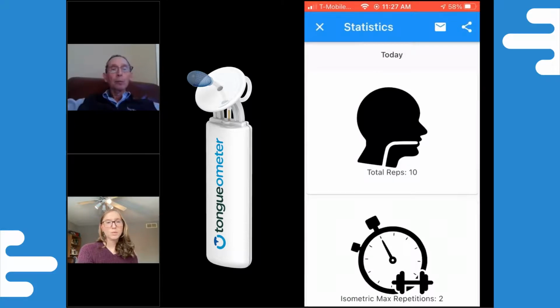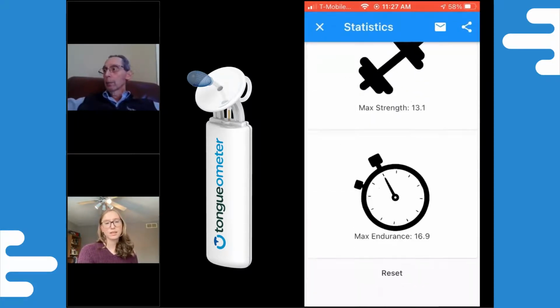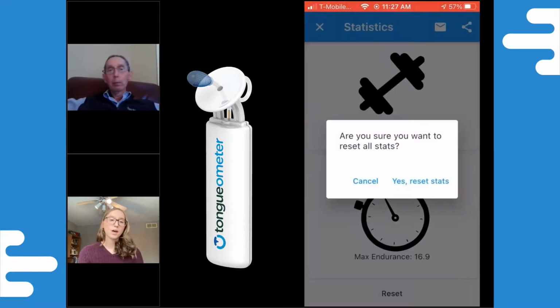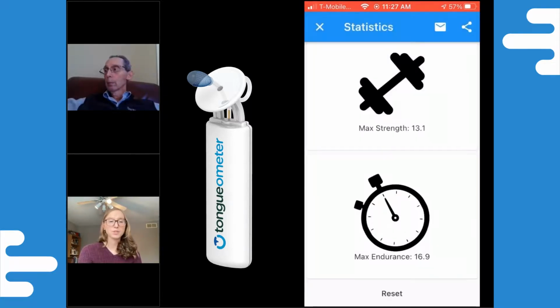And then also, if you wanted to reset the data, if you were using a shared tablet or phone in the clinic and you didn't want to carry over that exercise data to another patient, you can click reset and it will prompt you with a pop-up that says, are you sure? Once you clear all of the exercise data, you can't get that back. So be careful when you press that, make sure that you want to.